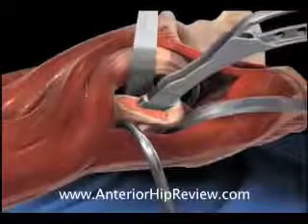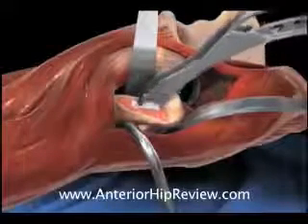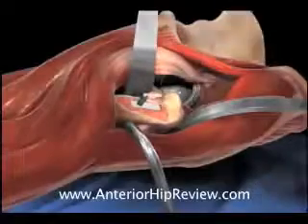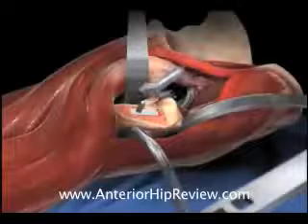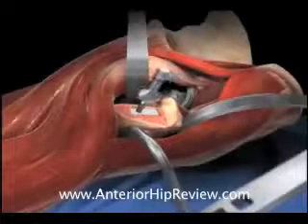Once the final broach is in place, trial components are assembled on top of the femoral broach and the hip is put back in the socket — a process that we call reduction — in order to trial the fit of the components.